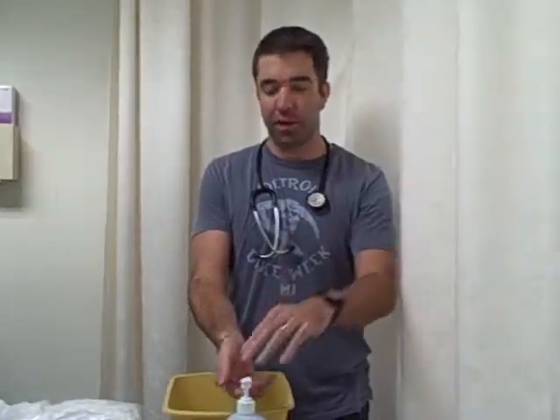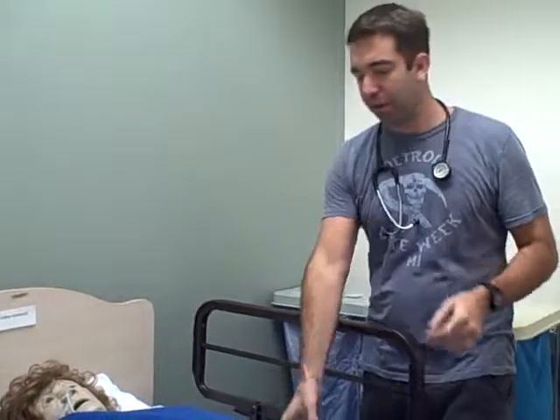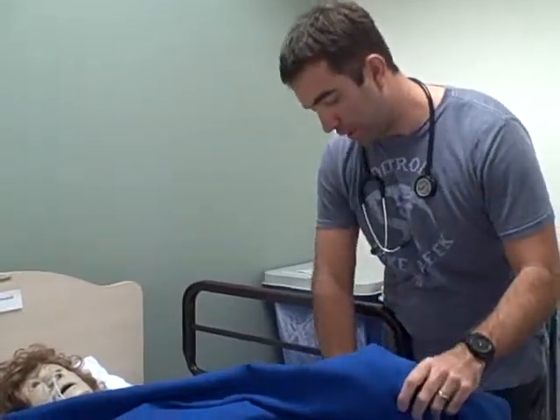Again, I'm going to be doing an abdominal assessment first and then a straight catheter demonstration. First thing I want to do is provide privacy to the patient, which I have done. Wash my hands. I'm going to identify the patient, make sure the patient tells me the correct date of birth and identification number. And I'm going to verify that on the wristband. Looks good.